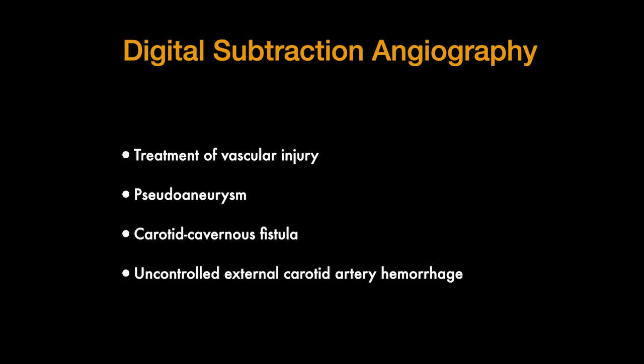Digital subtraction angiography, which used to be primarily a diagnostic method in trauma, is now really limited to treatments for vascular injury, which are usually detected by CT angiography. What would require treatment: pseudoaneurysms, carotid cavernous fistulas, and any kind of uncontrolled external carotid artery hemorrhage.